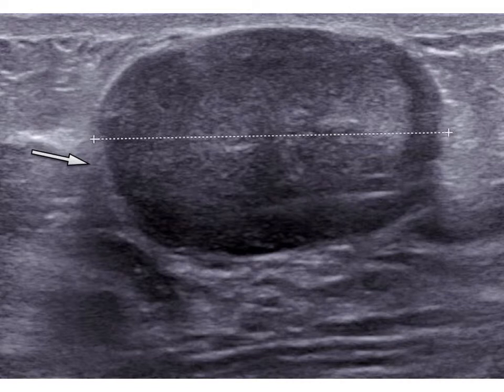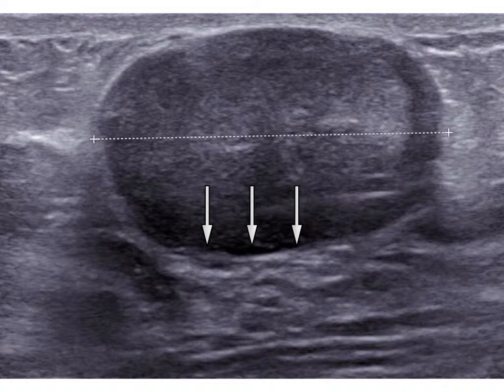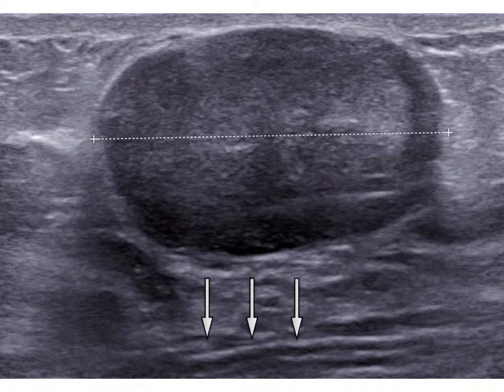Next, see the shadows extending downward from the edges of the tumor? This is called edge shadowing. Finally, see how the tissue below the tumor is brighter than the surrounding tissue? This is called posterior enhancement. Posterior enhancement and edge shadowing occur because benign tumors act like a lens to focus ultrasound waves towards the center of the tumor.